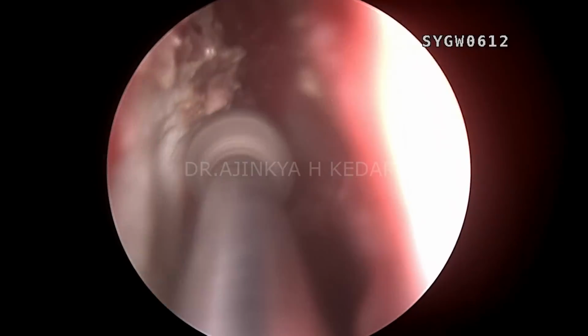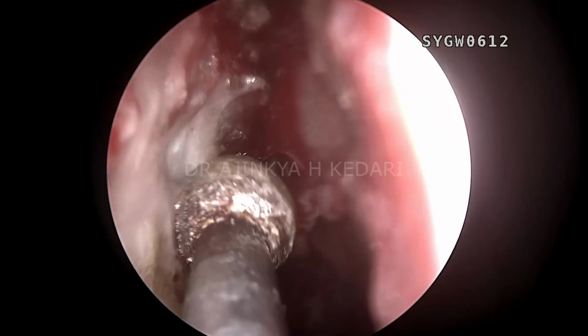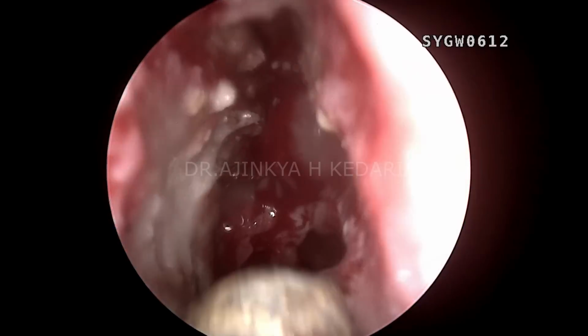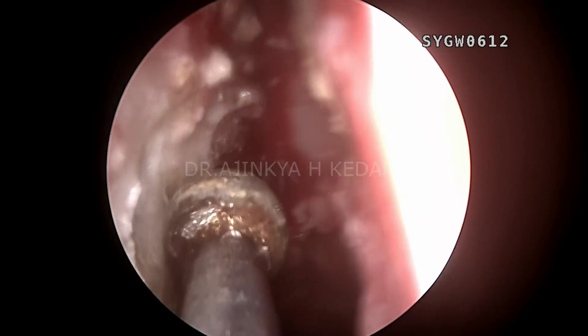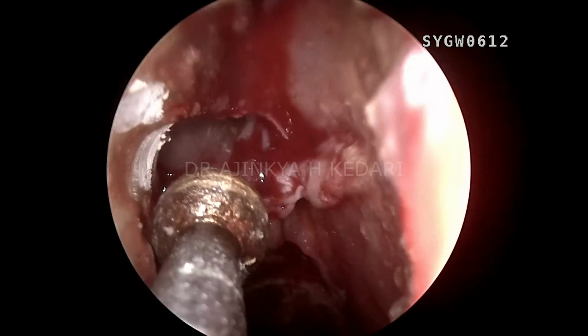See, I'm again drilling on the frontal process of the maxilla. So we are very superior to the orbit. The place where we are drilling right now is actually superior to the orbit. So this is not the lamina papyracea. The lamina papyracea is way below the place where I'm drilling right now.